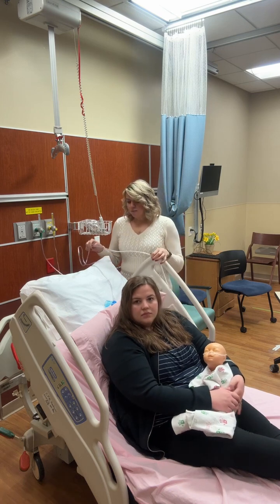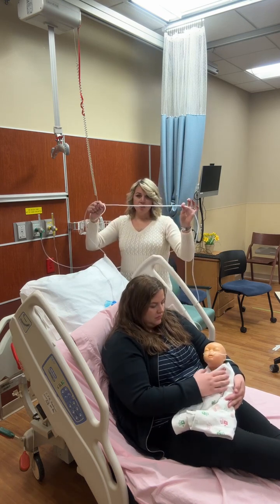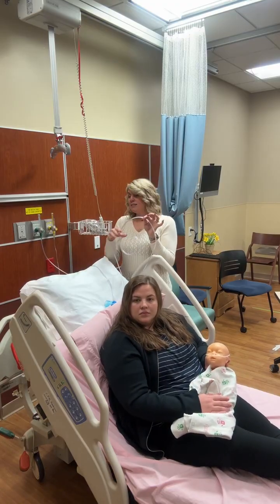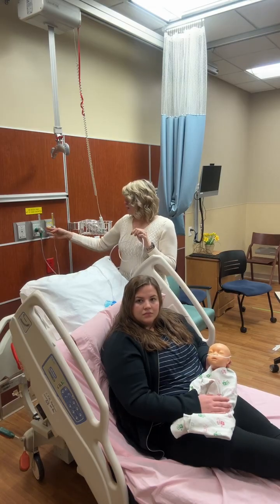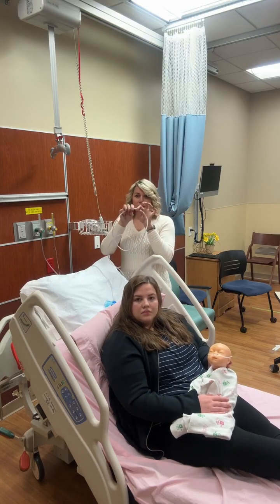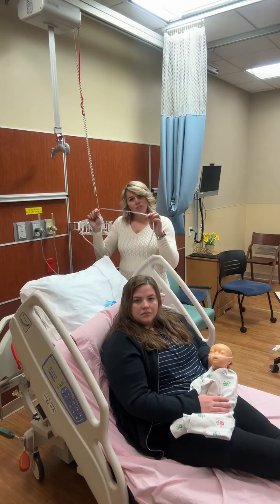And then in some situations, I forgot to say this earlier, but if your patient has extension tubing, like sometimes there is a connector between what is on the patient's face and what is hooked up to the flow meter, make sure that that is together all the way, because it may look like your patient is getting the oxygen here and getting the oxygen here, but then there's a split in that connector of the 2 tubes, and that can happen a lot actually. So always check that as well.